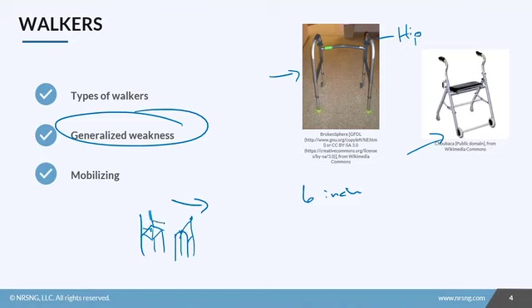Sometimes these chairs have armrests. Have them reach back and place an arm on an armrest to stabilize themselves. And then once they get their bearings and their balance, they can start moving forward.